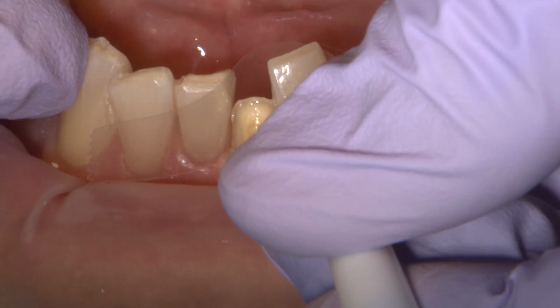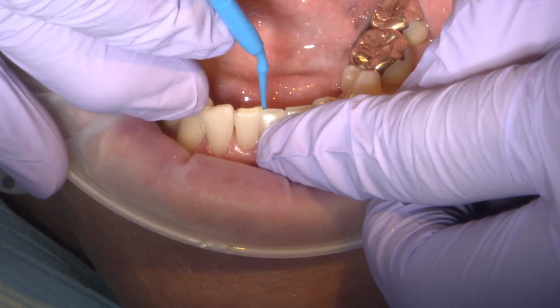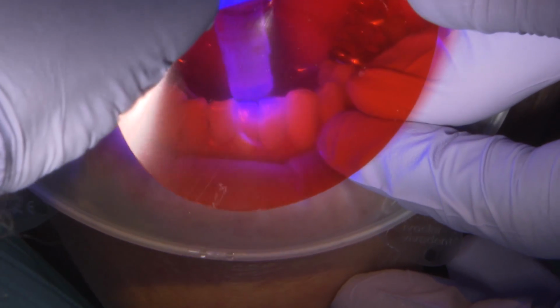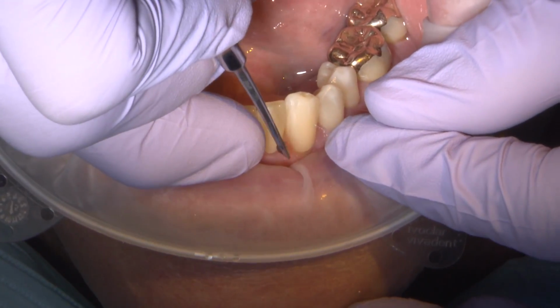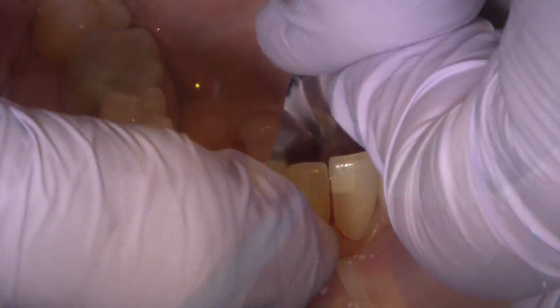For the cement, we use VariLink Esthetic resin in a neutral opacity. Once they're placed, we remove some of the excess with a microbrush and then tack cure along the restorations to aid in the removal of the gelled resin cement. Serrated interproximal finishing strips can also be helpful if some stubborn cement remains.